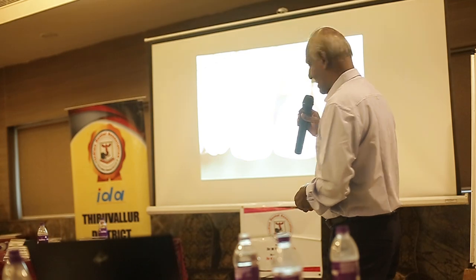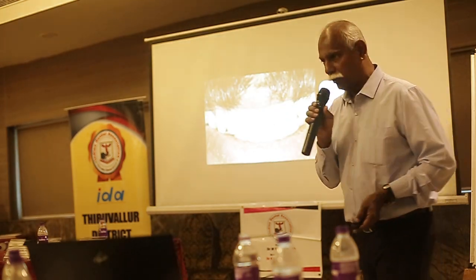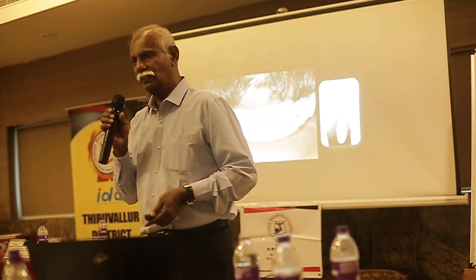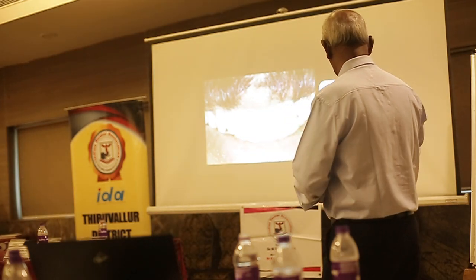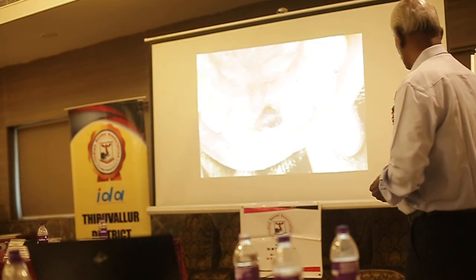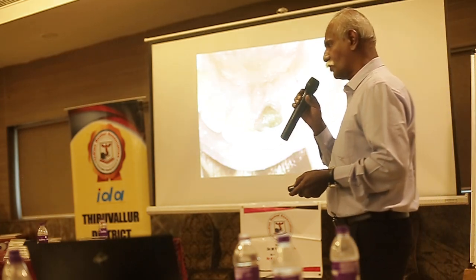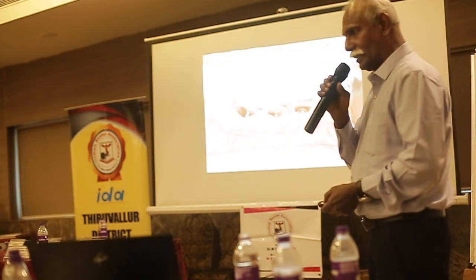This was tried in all the dimensions, luted with temp bond. Retrievability is very easy if you are using temp bond. And this is the scenario after luting. You allow a good amount of time for the soft tissue to heal. This is what you get. Same thing with multiple teeth also.